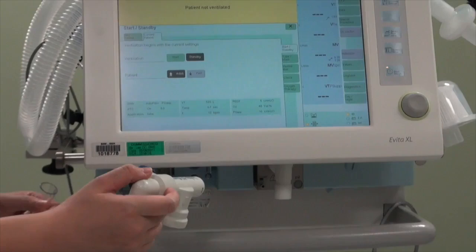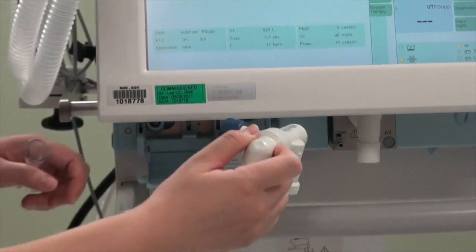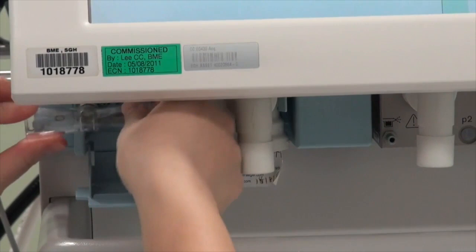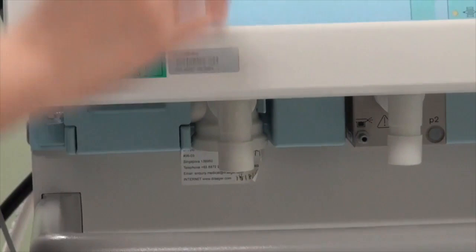Put in the exhalation valve first. This is a reusable exhalation valve. Your exhalation valve might be blue in colour — that is the disposable or single patient use exhalation valve. Once it's in, there will be a click sound, then insert the flow sensor and slide it into the exhalation valve, and close the protective door cover.